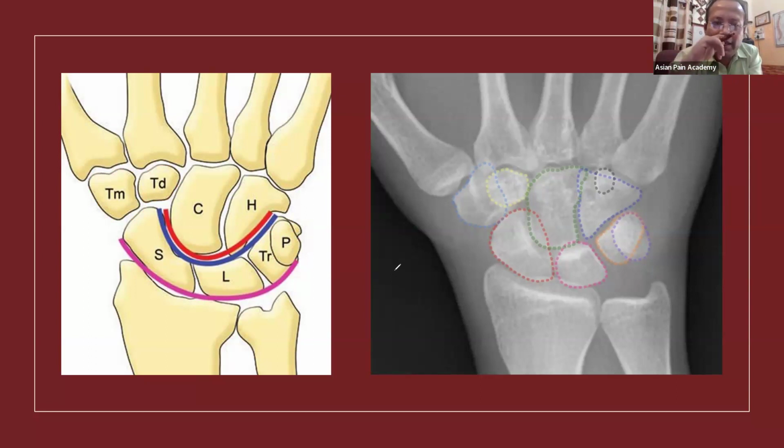Why I am saying this? There is the importance of this thing, because when we put our ultrasound probe, you cannot put the ultrasound probe in a curved way. You have to put in a straight way. So every bone, when we have learned that proximally it is the scaphoid, lunate, triquetrum, pisiform, you will not be able to see them all at once, because they are not in the same line, they are curved. Okay, so this holds true for the upper row also.